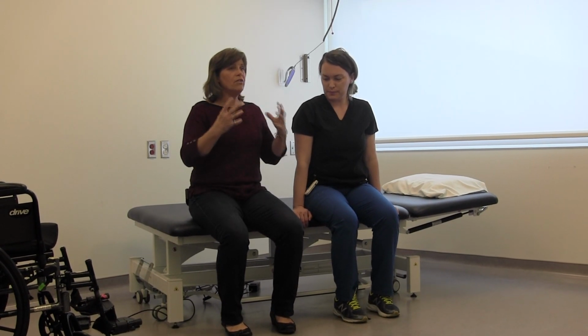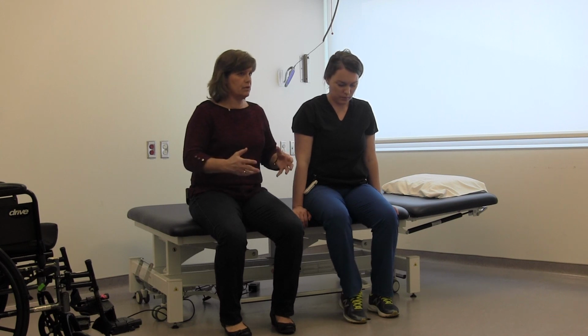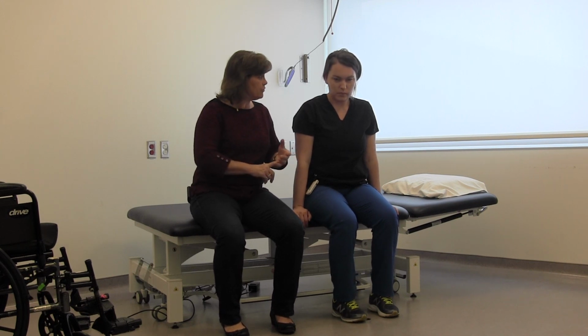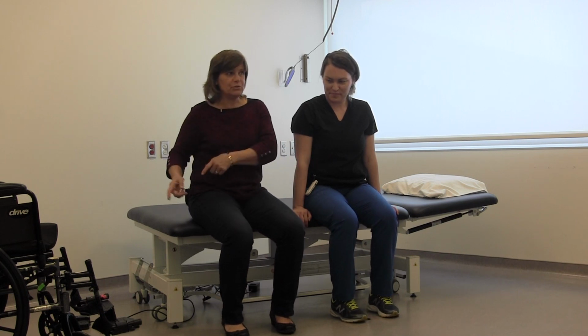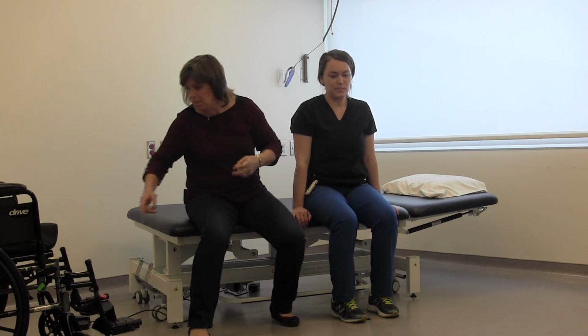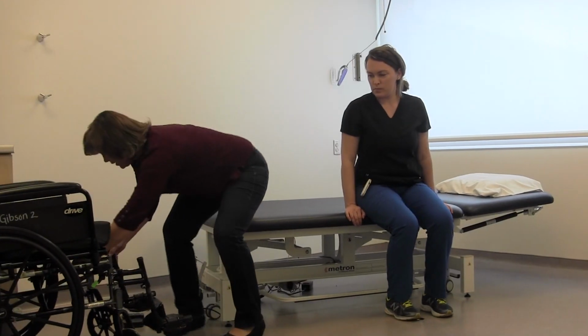Okay, so those are all the things that we have to think about in terms of preparing someone for a transfer. So we're going to do a sit pivot transfer, and we're going to get Annette all prepared, and then we're going to transfer to the chair. Okay? So bring this over. I'm actually going to get the foot pedals out of the way.